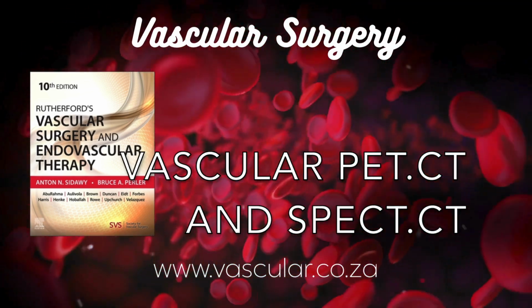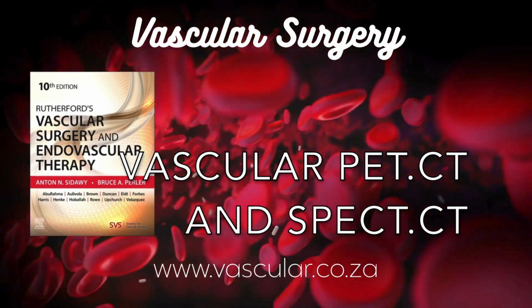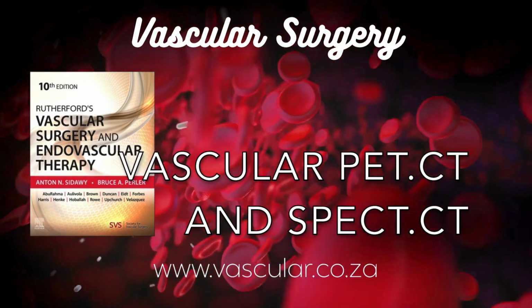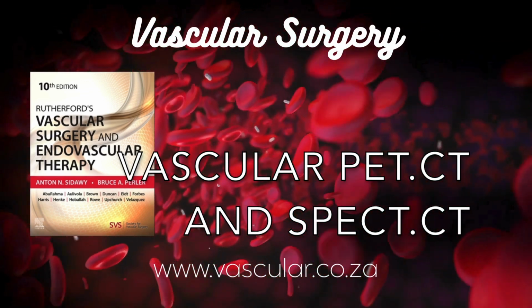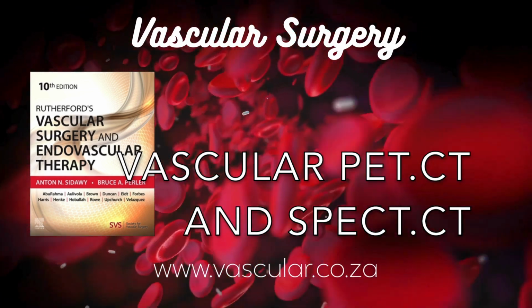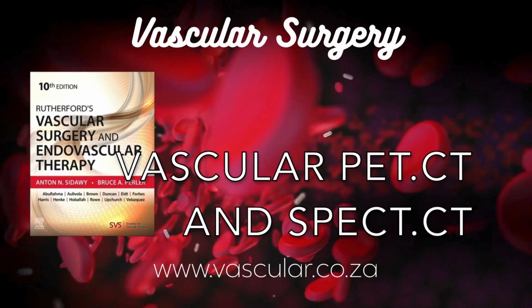Like inflammation. Inflammation's a big one, yeah. It can be brewing in the vessel wall, maybe setting the stage for a plaque to become unstable, but it might be totally invisible on a standard angiogram until it causes a significant narrowing or change in shape. So we're aiming to catch the trouble before it becomes a big structural issue, which brings us to molecular imaging. What's the basic idea?